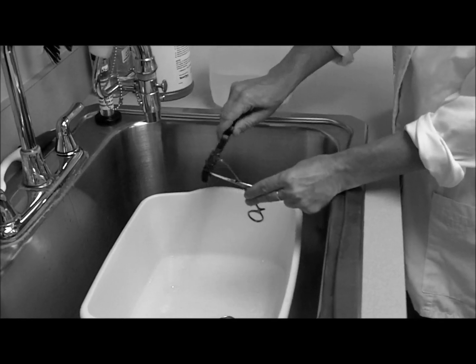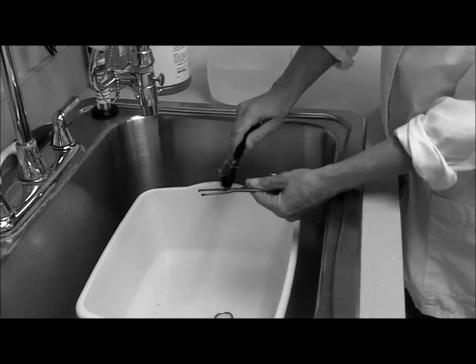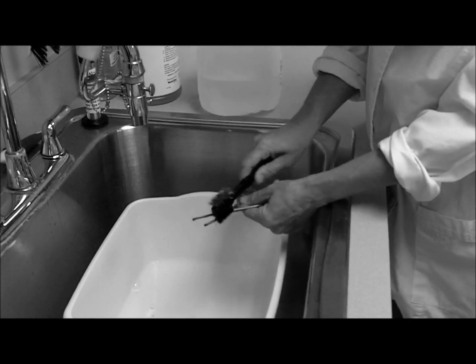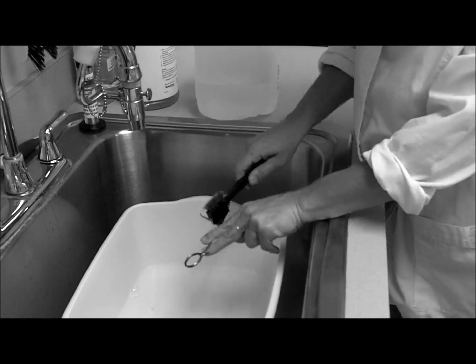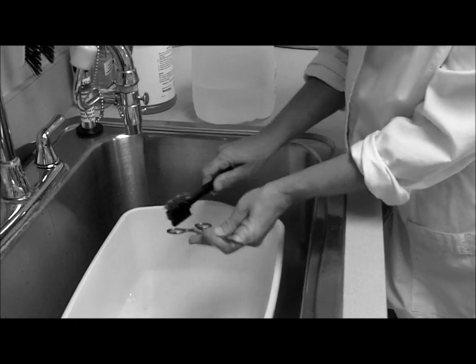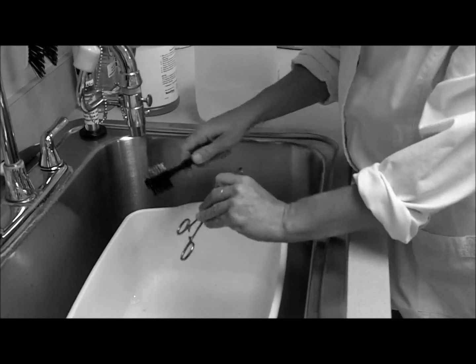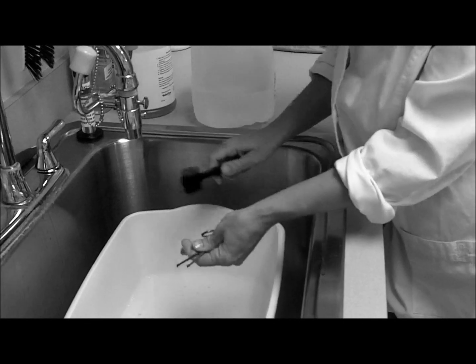First, you start with the tip. Then you move to the box lock, down to the shaft, to the ratchet, and then to the ring handles.